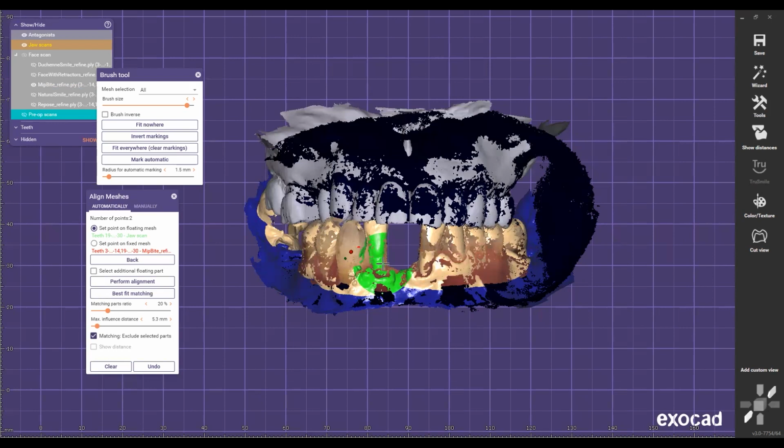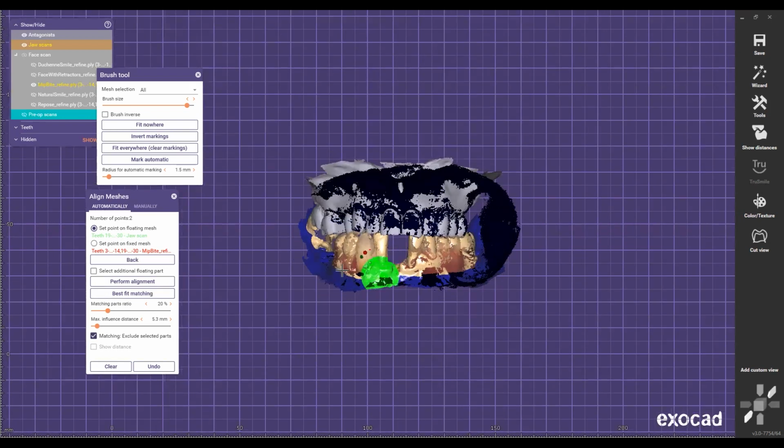There's nothing on the market right now that you can use as a bite scanner, especially a facial scanner, right? So we have proprietary techniques and workflows that are very unique and different from what's on the market right now. And a lot of doctors using technology like photogrammetry get the benefit from us by integrating this type of technology in their practice and combining it with iCAM, PIC, micromapper, all these technologies, so they can improve their workflow. So that's something that we bring to the table.